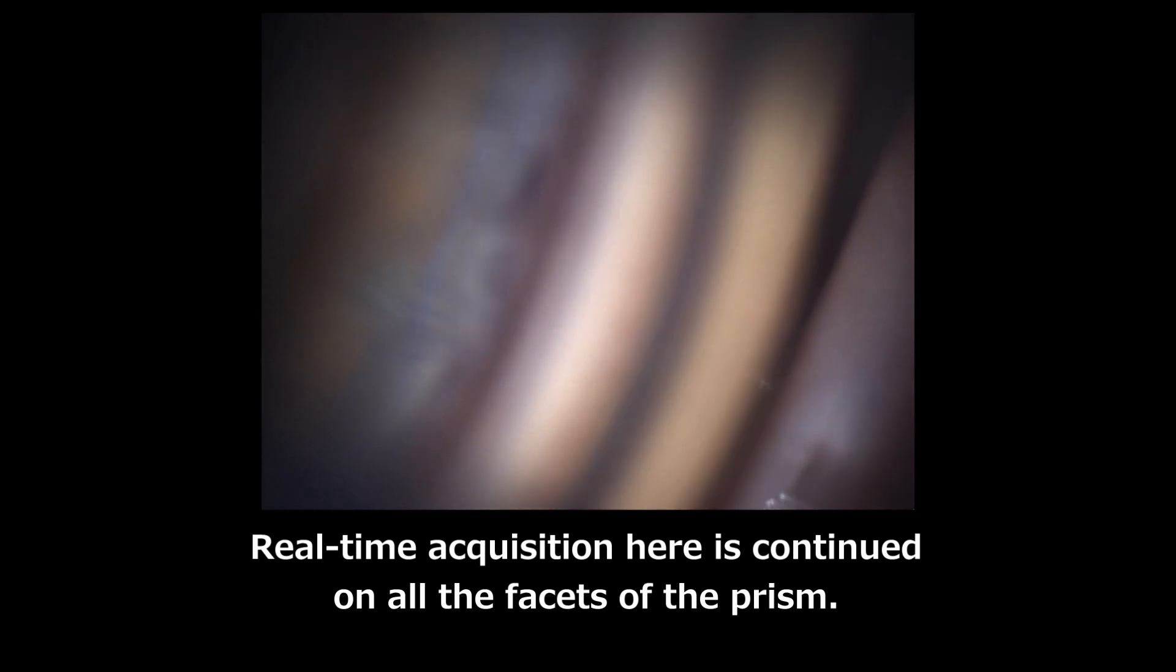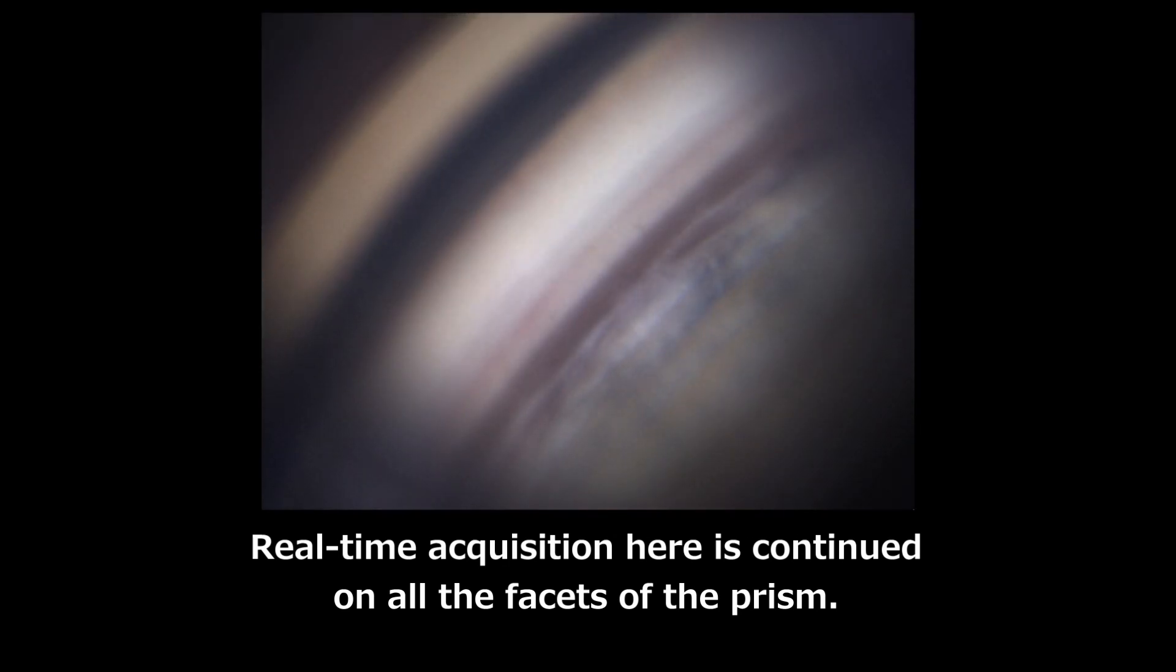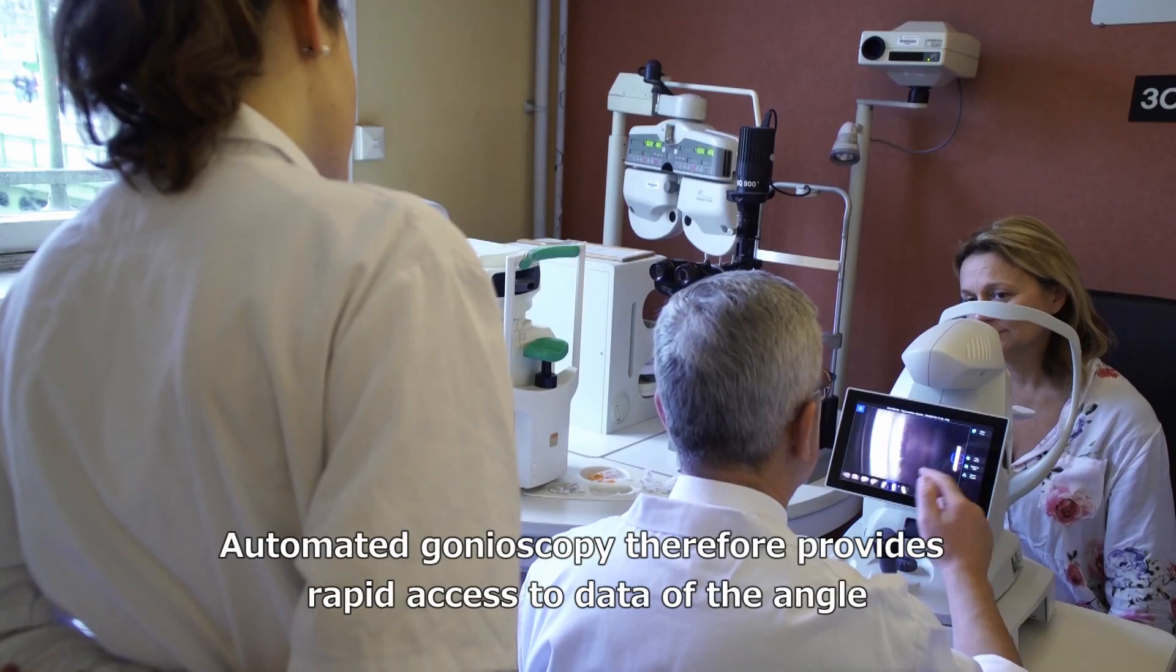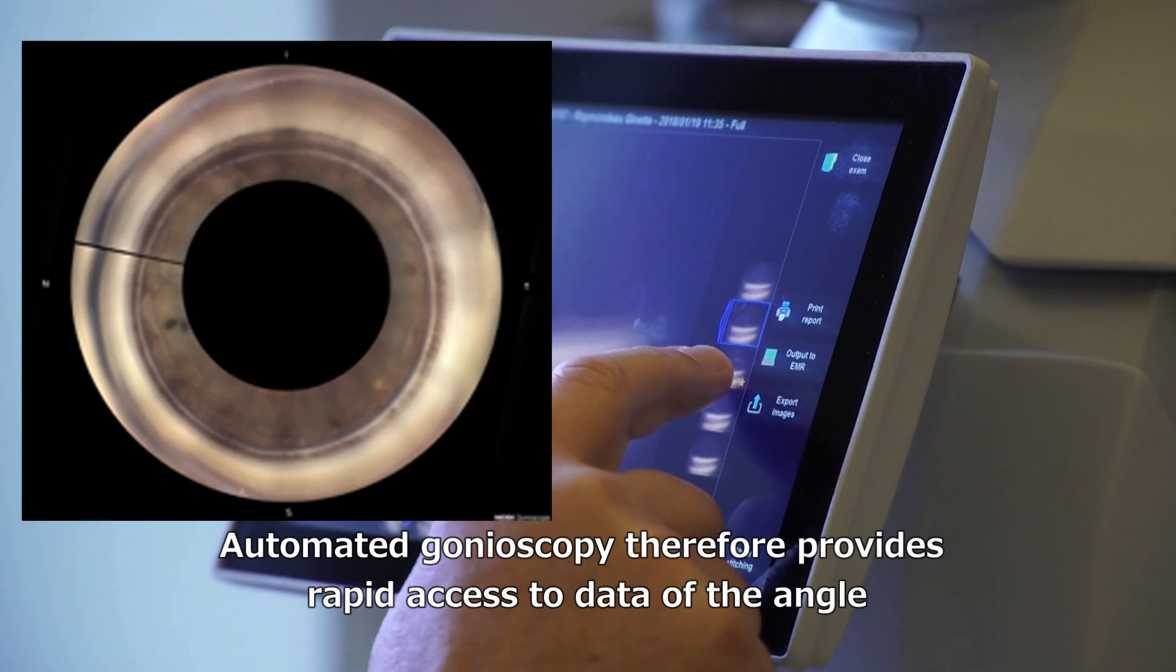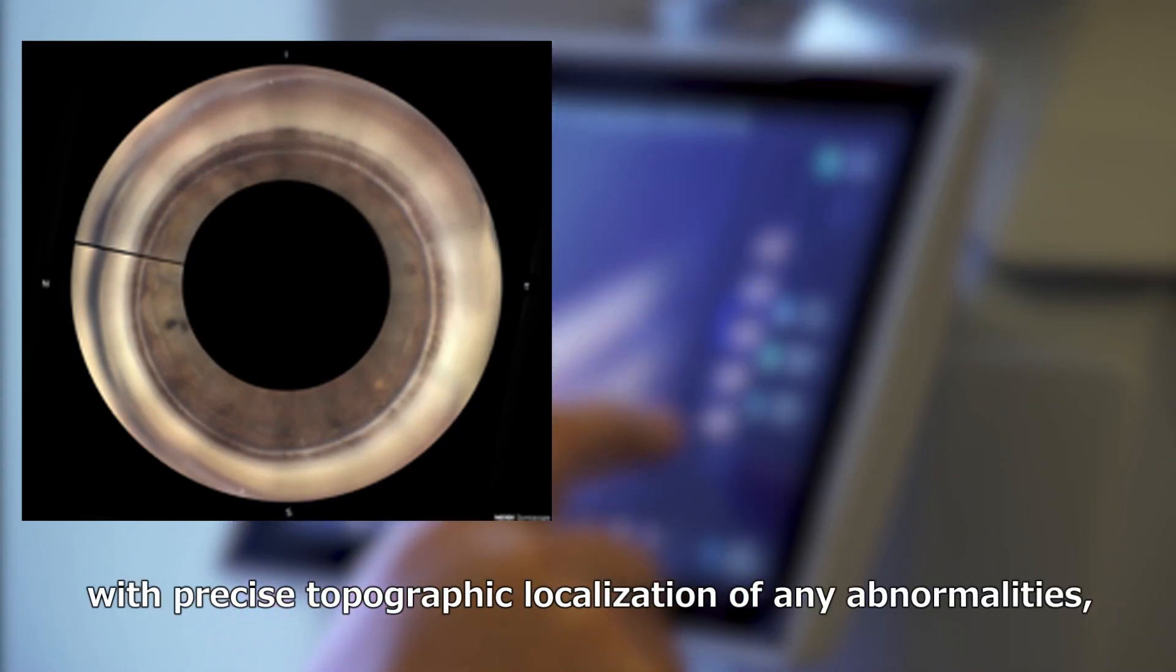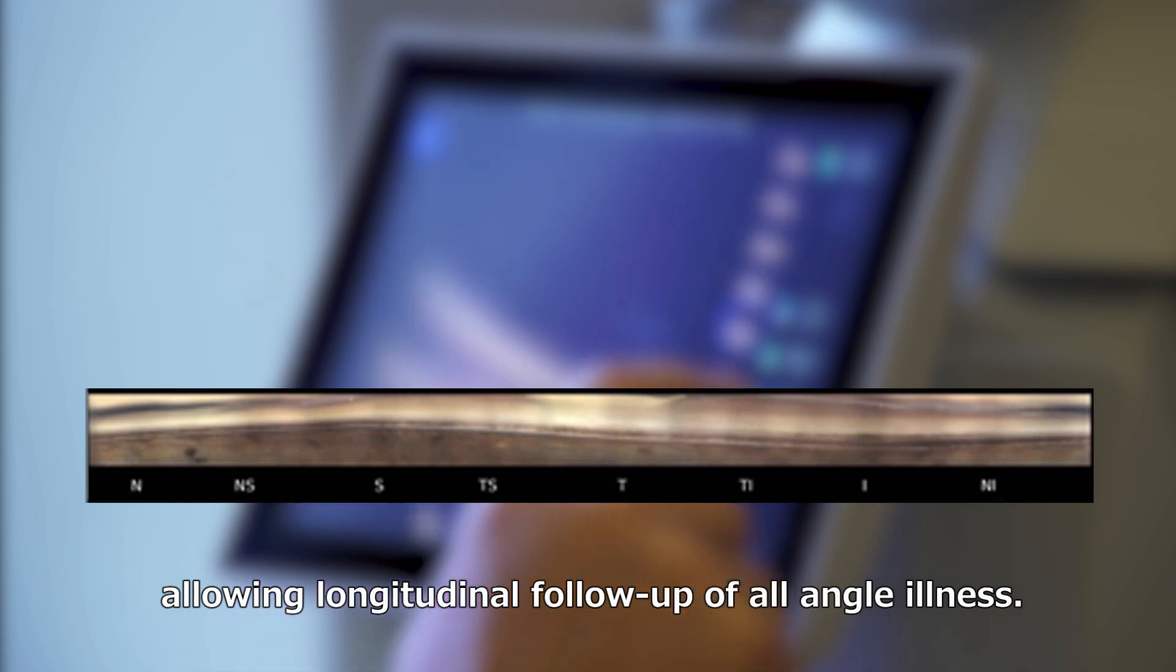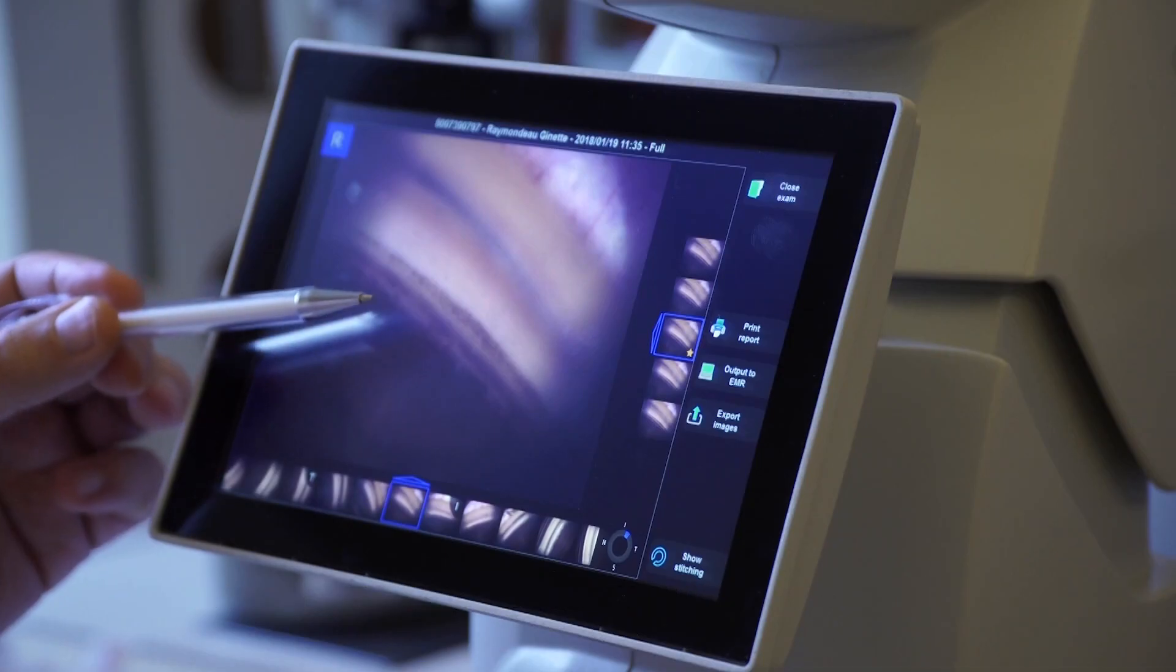Real-time acquisition here is continued on all the facets of the prism. Automated gonioscopy therefore provides rapid access to data of the angle with precise topographic localization of any abnormalities, and longitudinal follow-up of all angular illness.